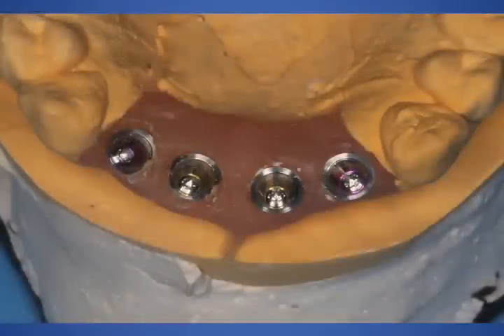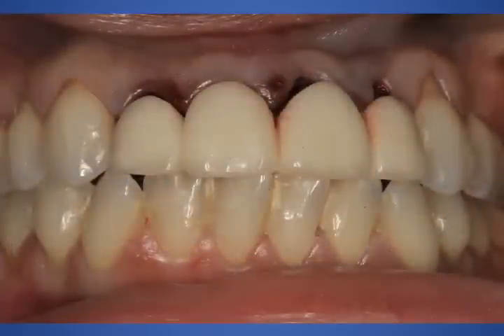Going back, the dental laboratory had given us this same positioning of the implants on a model prior to me ever touching the patient. Immediate seating of the transitional crowns, again, they are splinted for security.